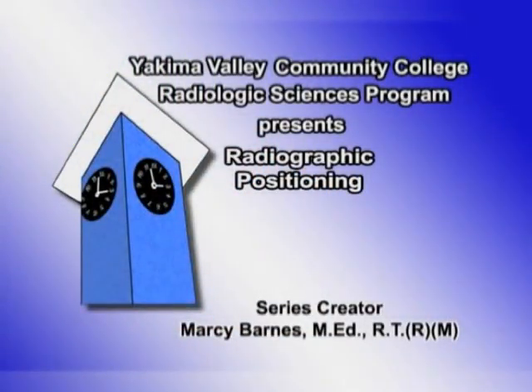Yakima Valley Community College Radiologic Sciences Program presents Radiographic Positioning. Knee.